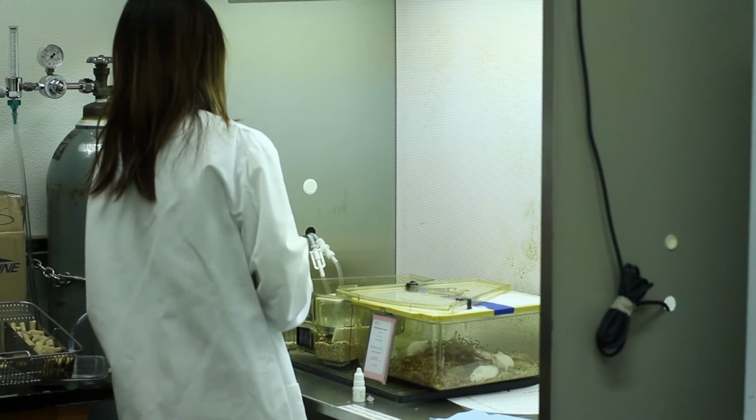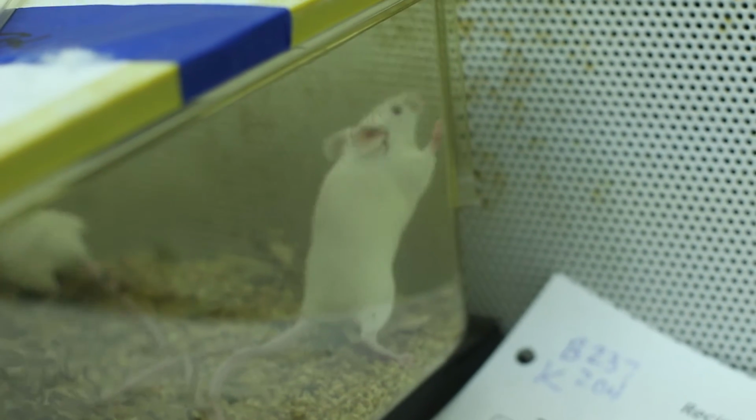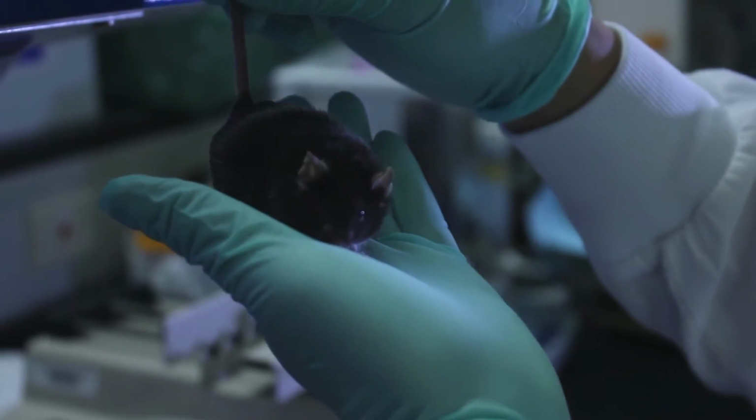The animal imaging shared resource is composed of 2 components, the Center for Molecular and Genomic Imaging and the Center for Imaging Sciences. The Center for Molecular and Genomic Imaging deals with small animals, rodents, typically mice and rats. A lot of the cancer models are in mice, and that's the type of animals that we deal with. Similar to the clinical arena for imaging humans, we can image small animals in order to understand human disease.